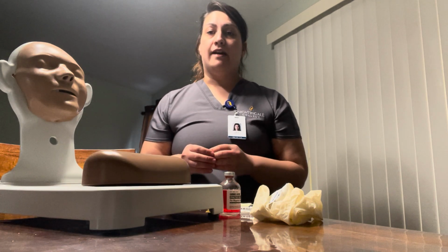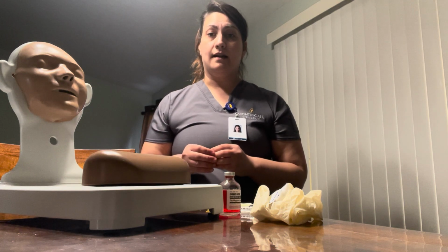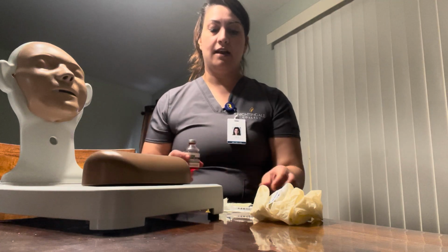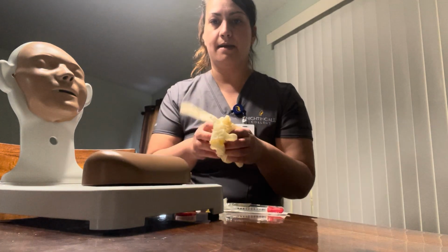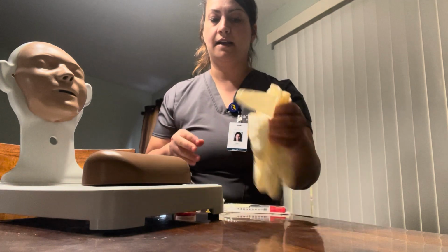So then I will verify in the MAR the patient's medication, which is heparin, and we're giving our patient 1 milliliter. All right, next I'm going to do hand hygiene. I'm going to apply my clean gloves.